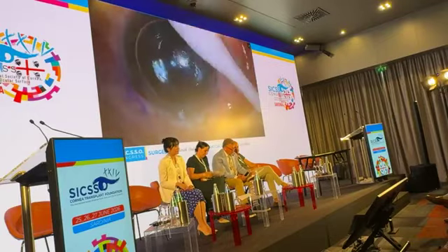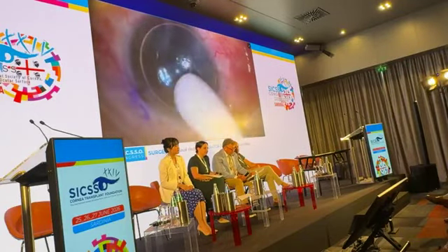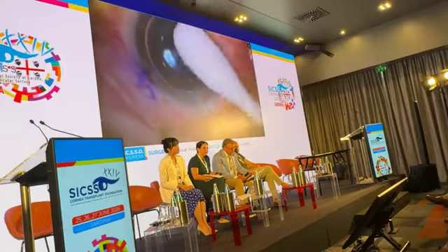However, there are a few patients in which he might decide to use gas, and those are generally patients with either vitrectomized eyes or eyes with an anterior chamber IOL, scleral fixated IOL, or also in cases in which Dr. Bozak expects the patient not to position well after surgery. But otherwise, his first choice for routine DMEK surgery is air.